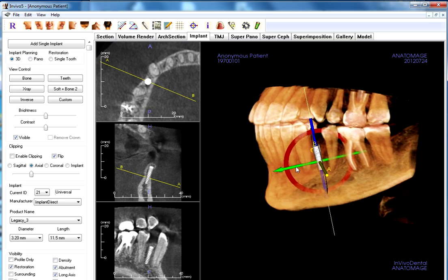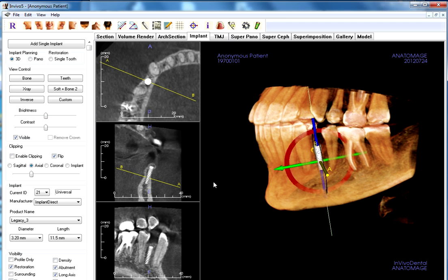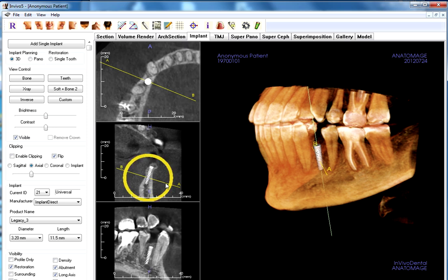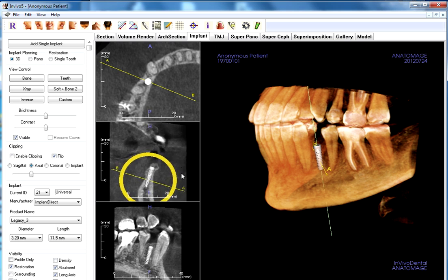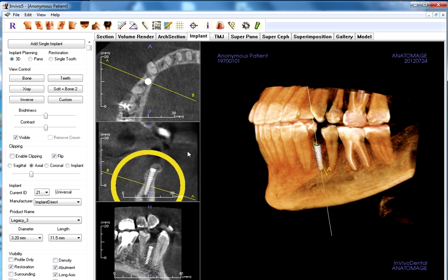I will usually take about five to ten minutes to put one of these in just to make it perfect, but for this demonstration I'm just going to get it pretty close to demonstrate how the software works. I can zoom in and take a look at right where this implant is going to be placed — the buccal and the lingual.